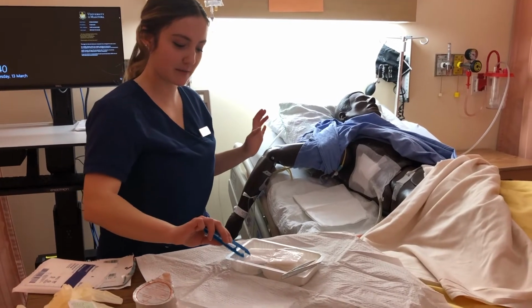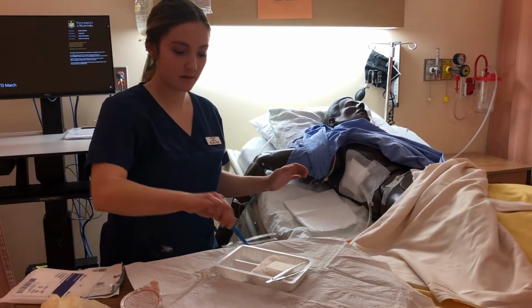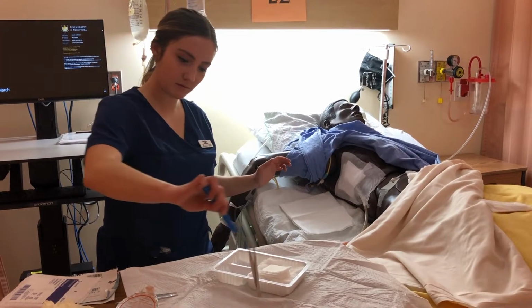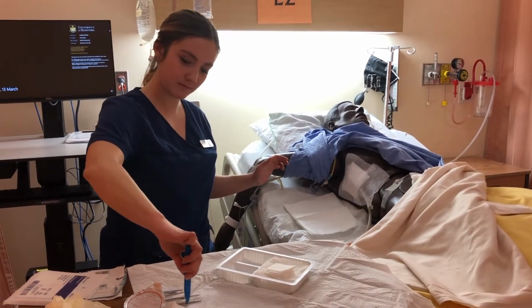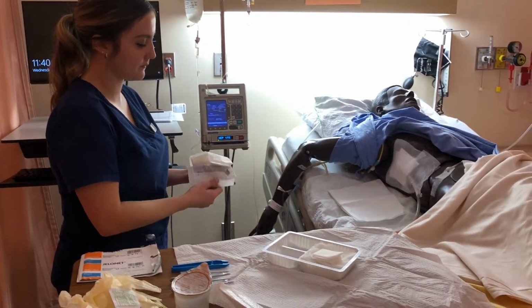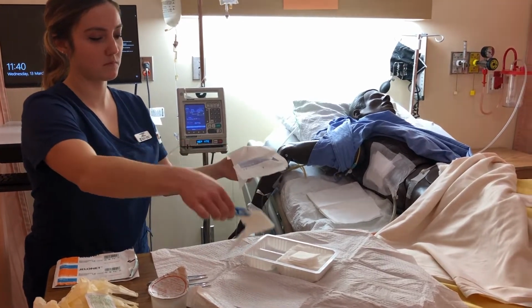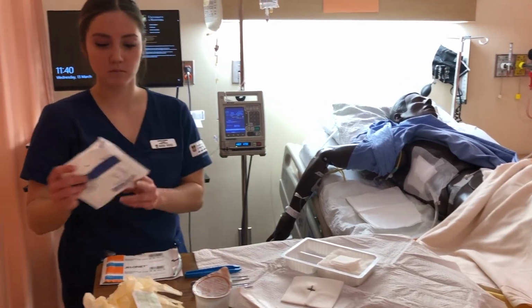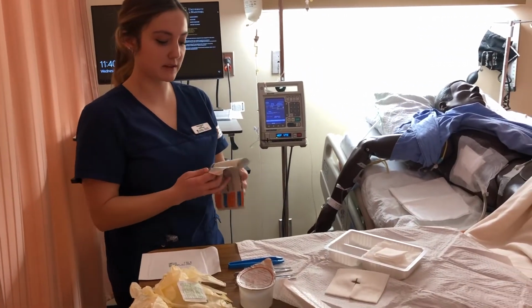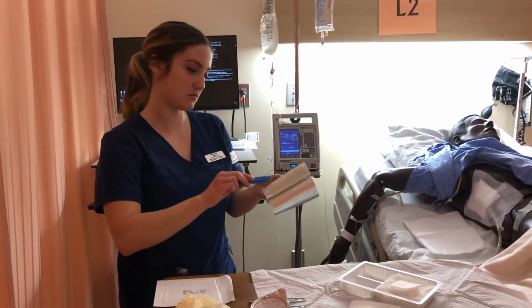And grab my garbage bag. Put this here. Still good. And I'm going to add my drain gauze, and my Xeroform or Adaptic dressing, which is going to go around the chest tube, if I can get it.